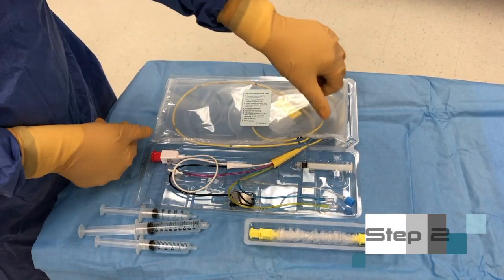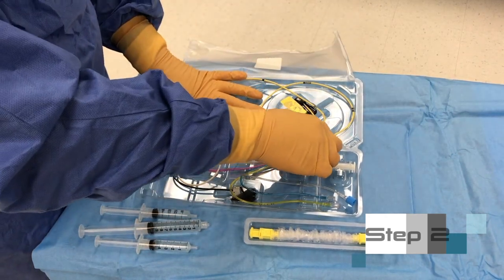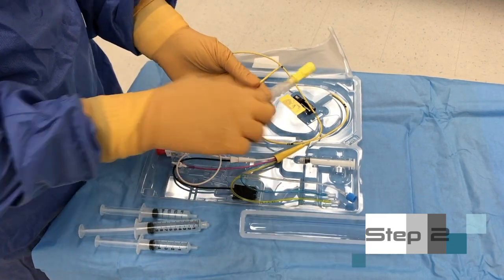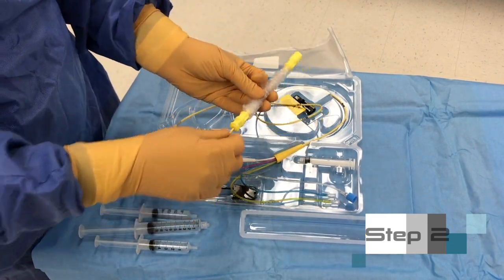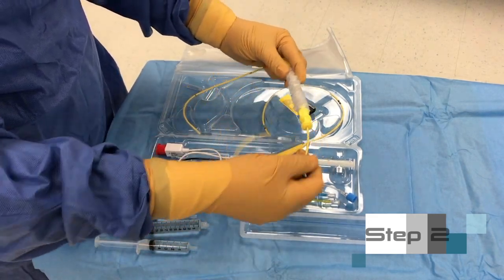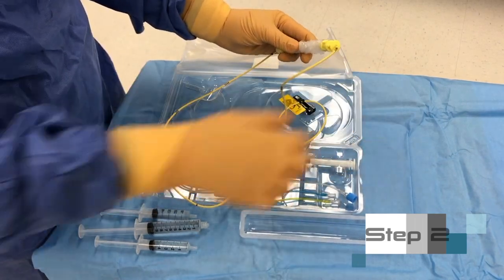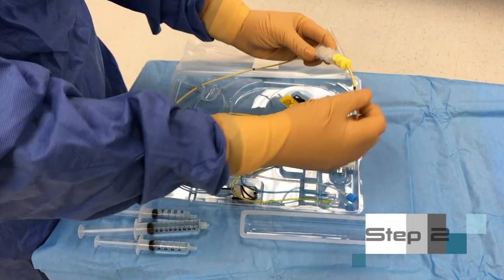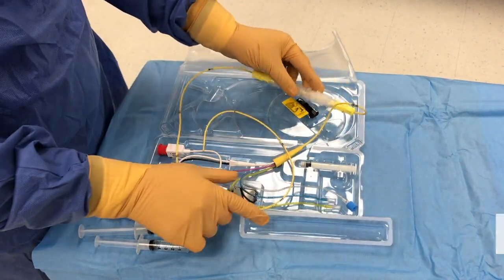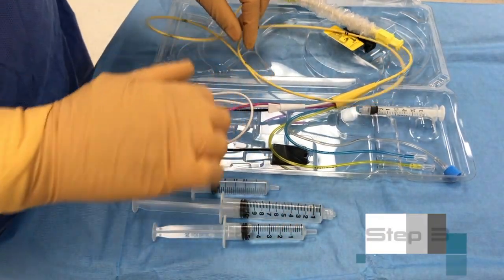Step 2. Remove the PA catheter from packaging. Apply the protective sleeve over the catheter. Step 3.